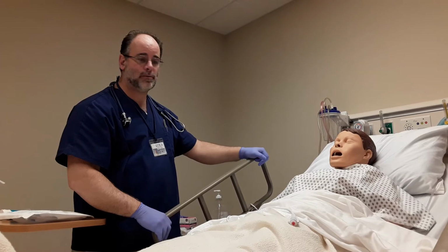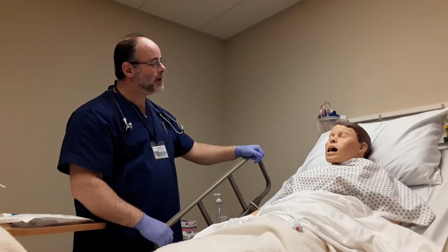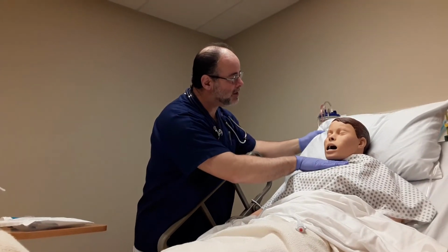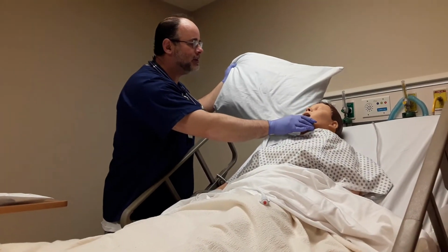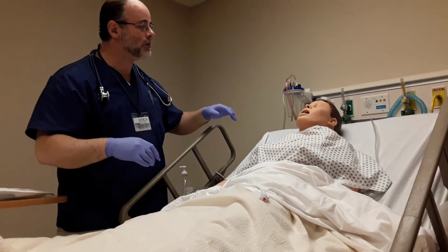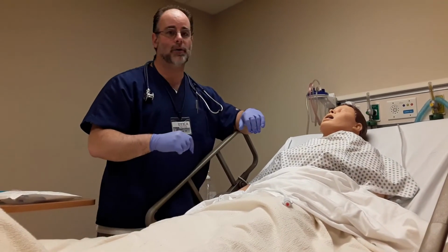Indicates he's never had a tube before. So, sir, I'm going to raise your head up a little bit. This may help with the passing. Okay. I'm also going to ask if I can gently take the pillow out from behind you. And he says I could, and I'm going to gently place his head back so I can get clear visualization once the tube is going past into the pharynx to see if there's any coiling going on.